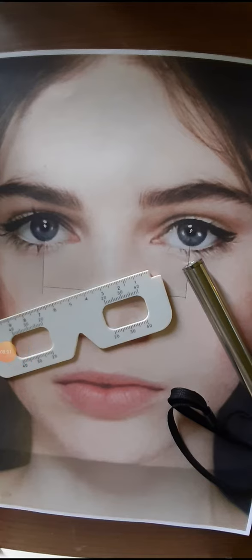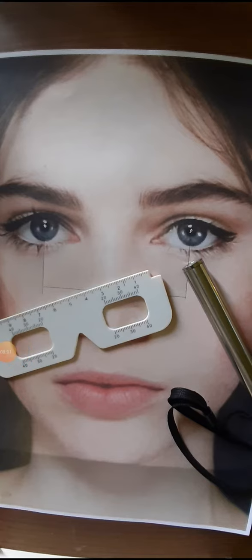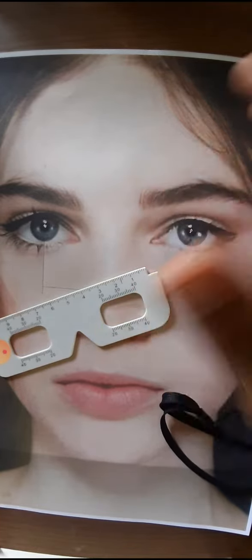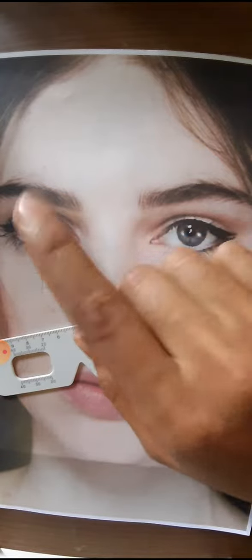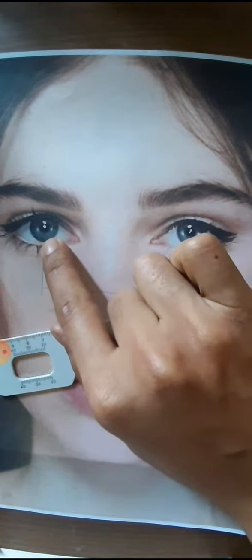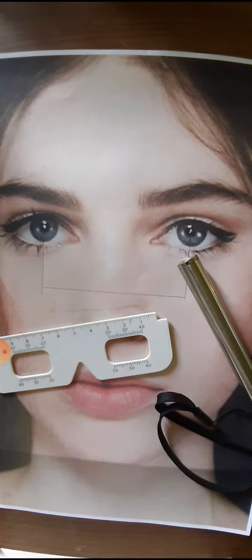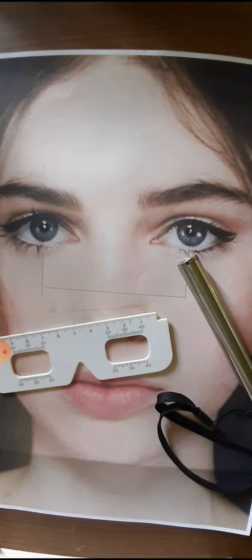Hello friends, welcome to my new video. Today I will discuss how to measure interpupillary distance of a patient who came to take spectacles. Interpupillary distance is the distance between the center of the pupil of one eye to the center of the pupil of the other eye. The visual axis of the wearer should pass through the optical center of the spectacle.